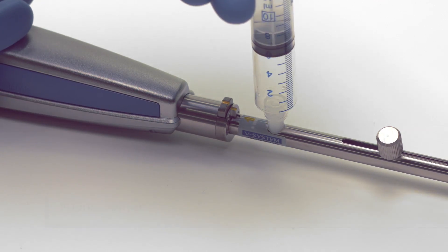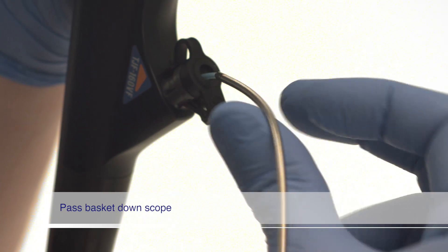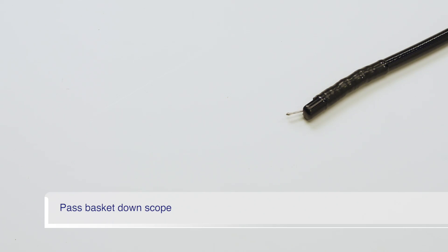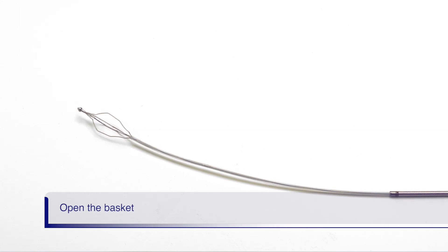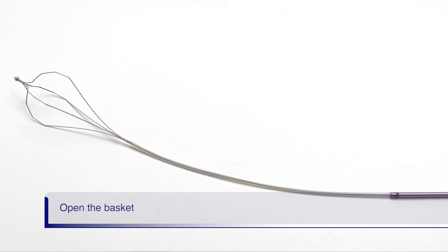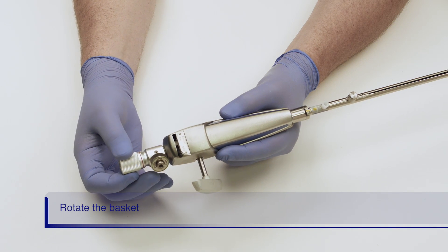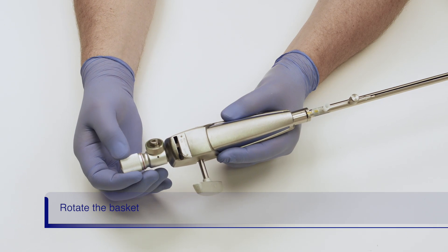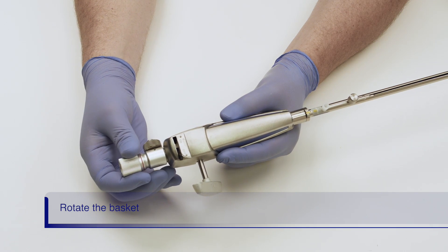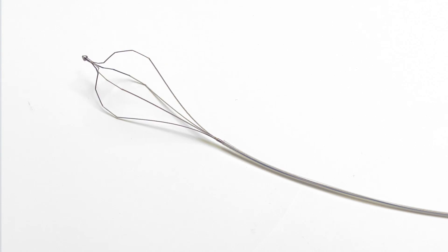After flushing, pass the basket down the scope into the patient's duct. The bullet tip version of Lithicrush V has a plastic sheath which helps prevent trauma when cannulating the duct. Once the basket is in the duct, open the basket by advancing the rod on the handle forward until the basket is fully deployed. Rotating the basket may help to acquire the stone. The basket is rotated by turning the rod on the back of the handle in either counterclockwise or clockwise direction. Once you start rotating the basket, you cannot change direction.